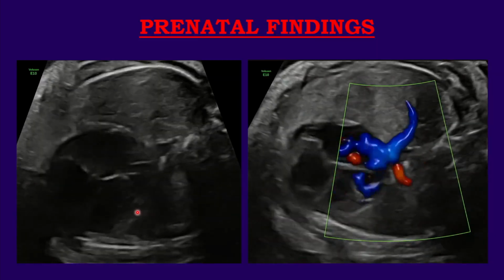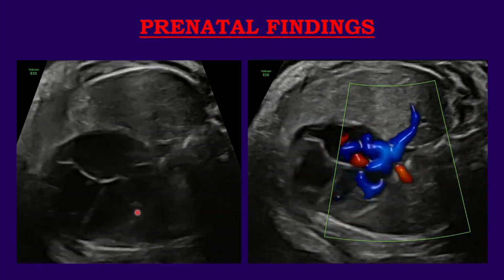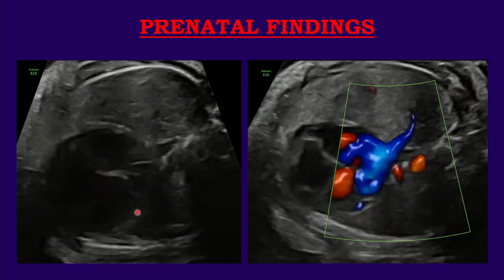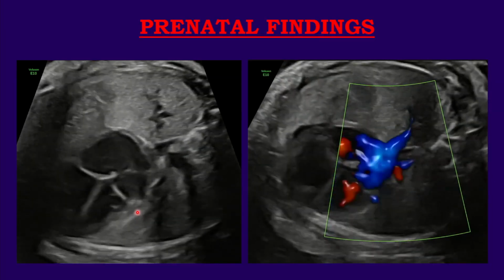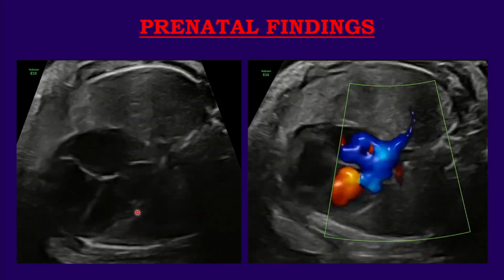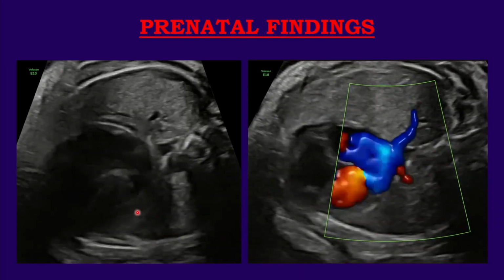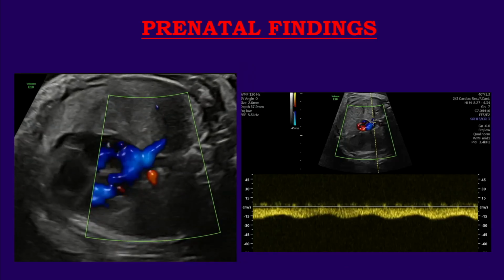Yes, right? I thought that too. Quite difficult visualization, 34 weeks gestation. Okay, so this is a little bit of discrepancy. It's because it's late third trimester. Move on. Yes? No? We need to get the spectrodoppler of the pulmonary veins.